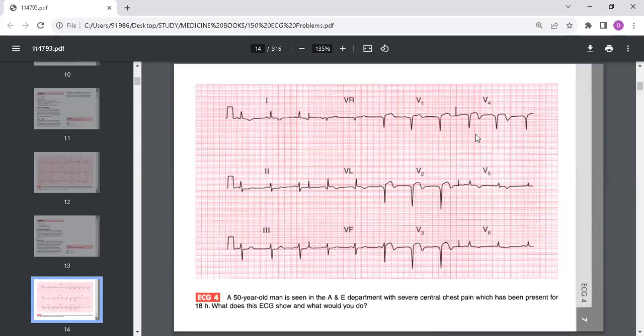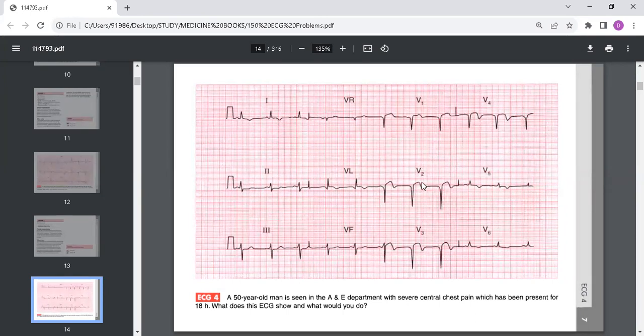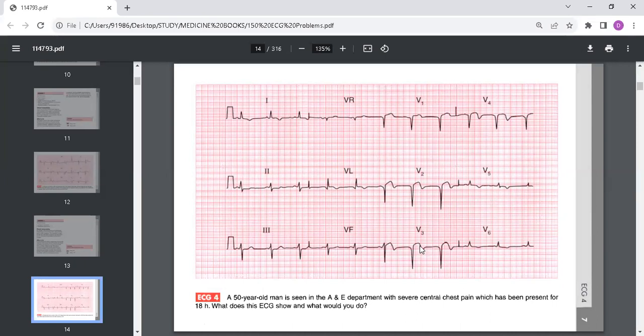There are Q waves in V2 and V4. There are raised ST segments in leads V2 to V4, and there are inverted T waves in lead 1, aVL, and V2 to V6. You can see T wave inversions in lead 1, aVL, and V2 to V6.